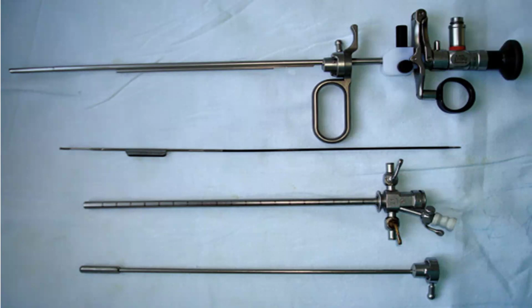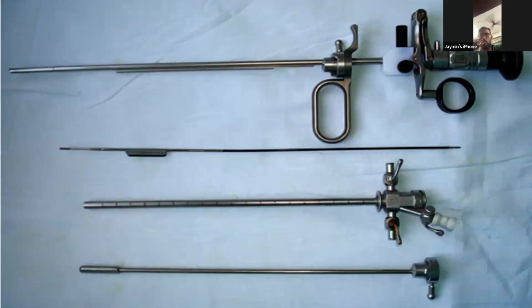So first, tell me what are the different types of obturator. Does this obturator belong to this sheath? Obturators, sir, can be mainly of three types: the cystoscopic sheath, the resectoscope sheath, and the one for the VIU sheath, sir. And this is a rounded end, non-visualizing obturator, sir. So it is for a VIU sheath. Okay.